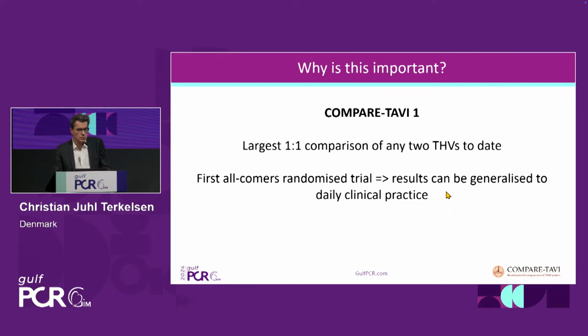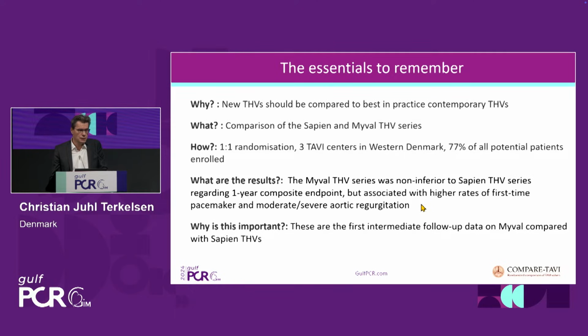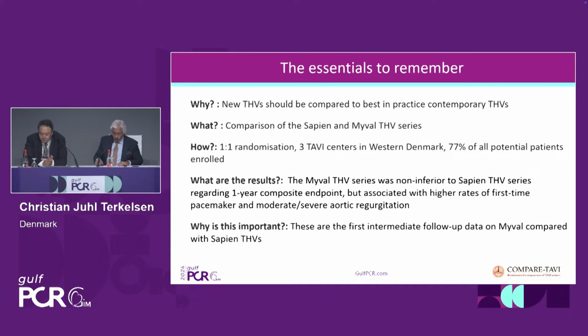So this COMPARE ONE is the largest one-to-one comparison of any two valves to date. It is also the first all-comers trial, so we think it can be generalized to daily clinical practice, and these are the essentials to remember. Thank you.